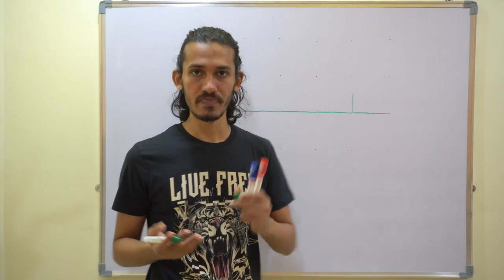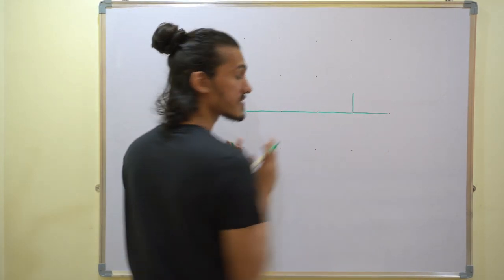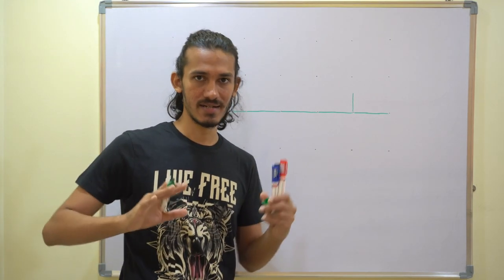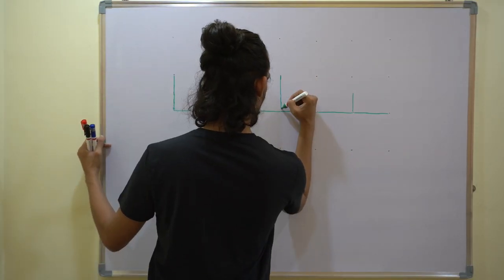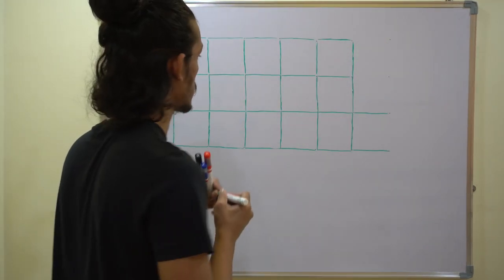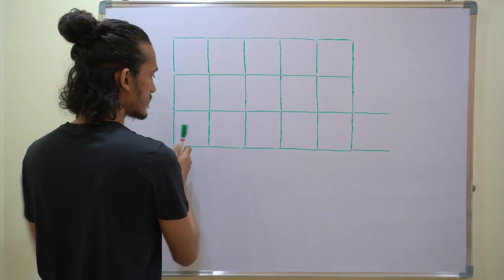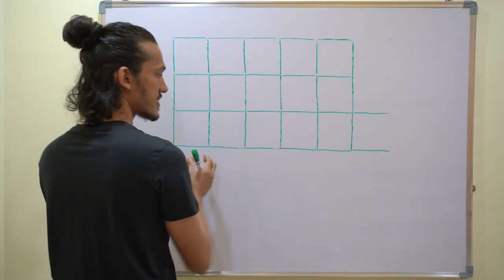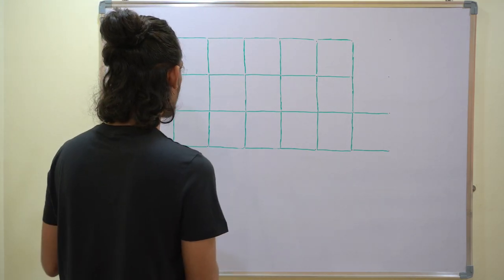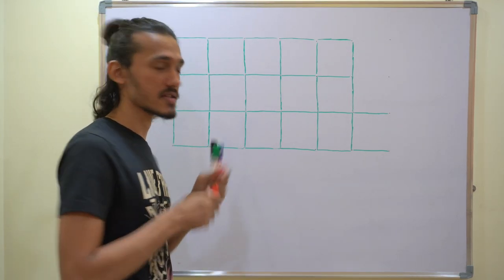So you get what I'm saying, right? In the end, this 25 millimeters forms 1 second. All right. Okay. So these are the large boxes, right? So this is totally 25 millimeters, and this accounts for 1 second. And these are further divided into 1 millimeter divisions. So 5 one-millimeter divisions are there in each of them.